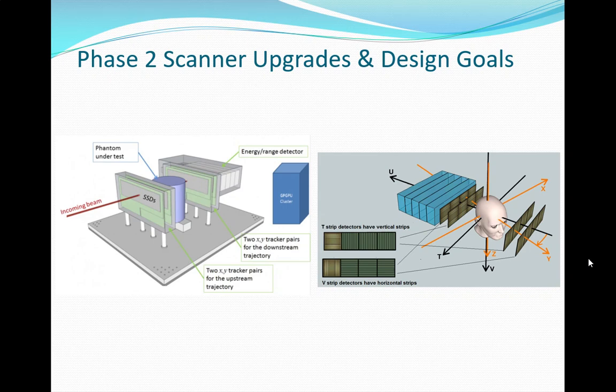On older systems, like Loma Linda, which was the first one that went in, it has a wider beam. Well, actually, it has a narrow beam, but they didn't have the scanning down yet. So they have a spreader that spreads it out, and then you put a bolus on it. Imagine lead, maybe about this thick, and then you cut the center to the particular shape you want. They will make a different bolus for each patient, with a depth adjustment for where you want it. If you just want generally open, you open up the whole thing, and you'll get a Gaussian curve centered in the middle, highest density, and then dropping off.